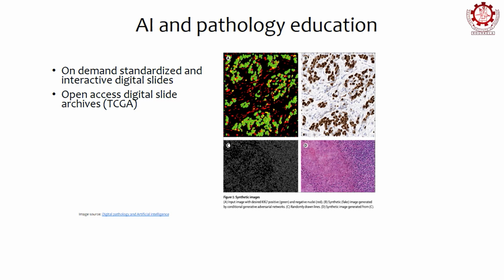And also, let's say that you are generating some data sets, you are generating some analysis results. You can upload your results to TCGA, right? Obviously, it's good if you have a corresponding publication. So one of the avenues that people have taken in the last few years is Nature Scientific Data.